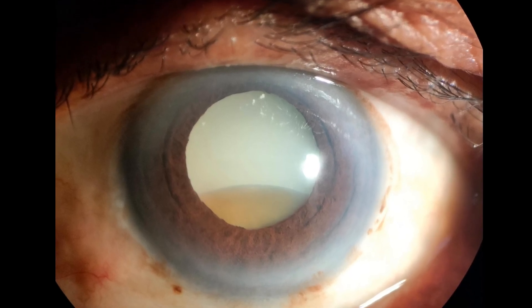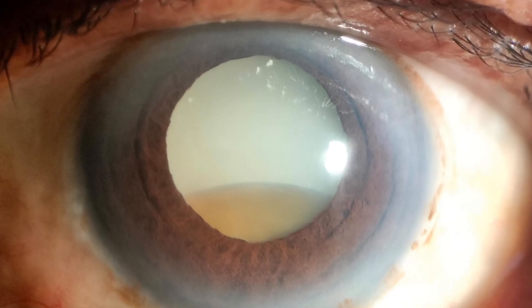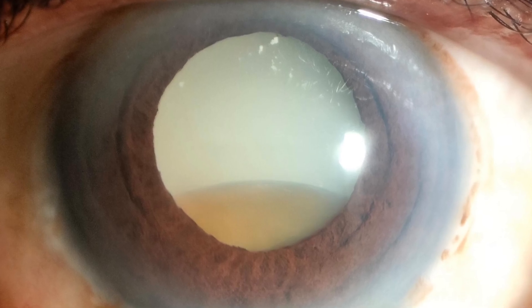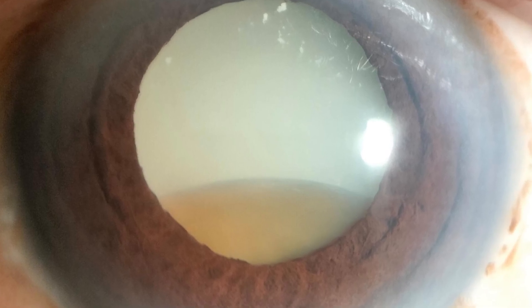This is a very interesting and awesome case with many things to learn. This is a hypermature Morgagnian cataract where the cortex has liquefied and the nucleus has gravitated down, appearing as a brown element in the inferior part of the pupil.